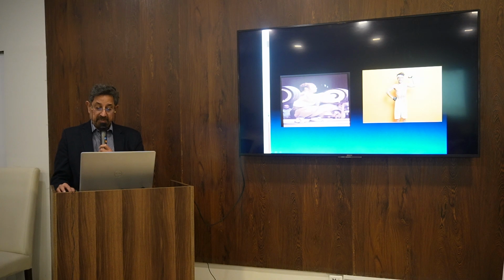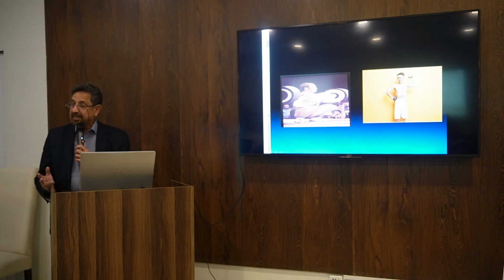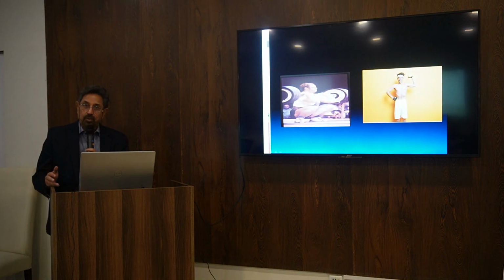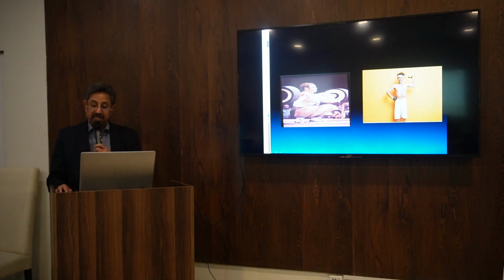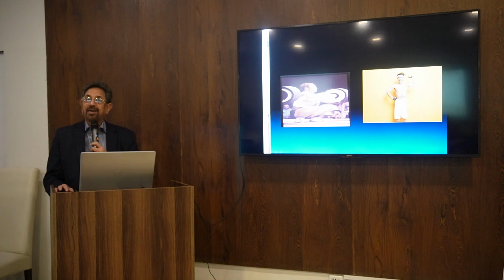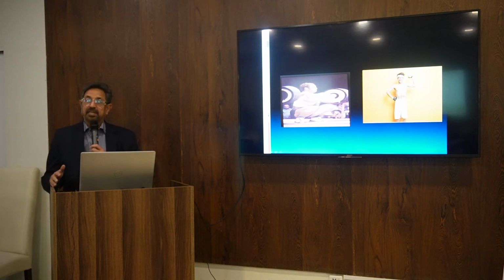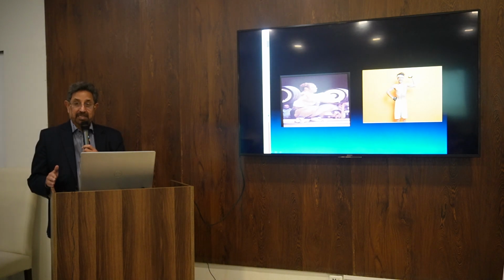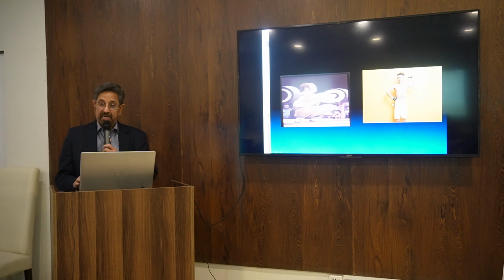In an obese patient, what will we use, low frequency or high frequency? We'll use low frequency, but not so low that we lose the good quality of the picture. And if there is a very thin patient, we have that benefit: we can use the higher frequency, get a very good picture, and it can penetrate enough in that patient. So that's an important factor.